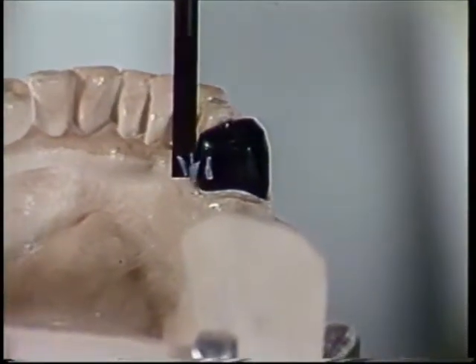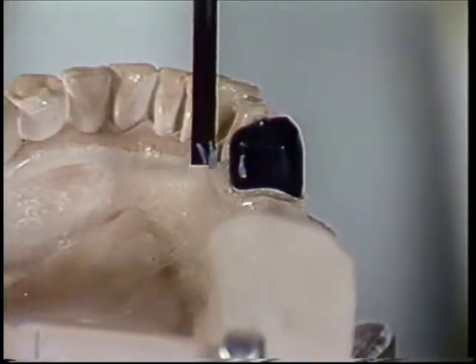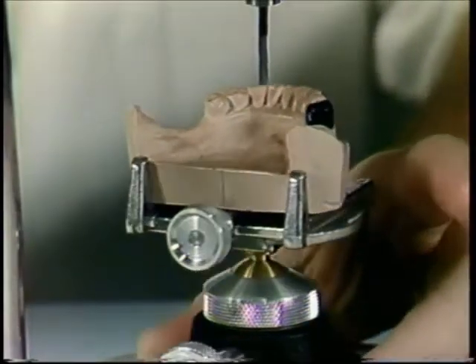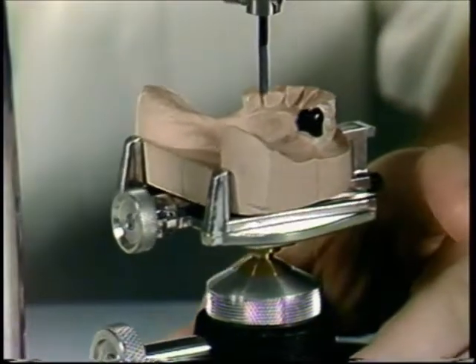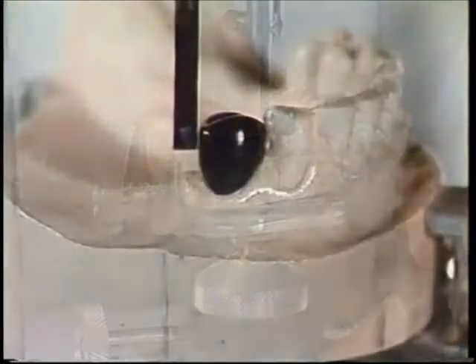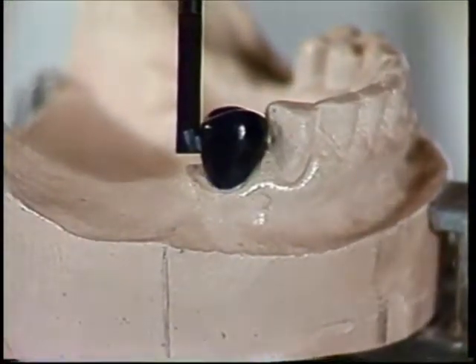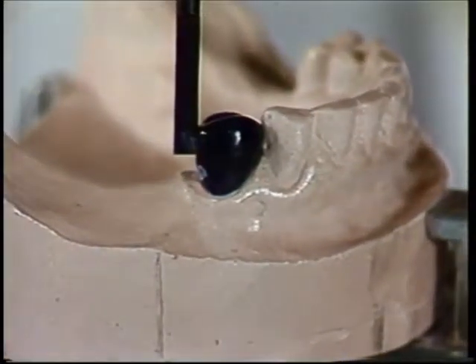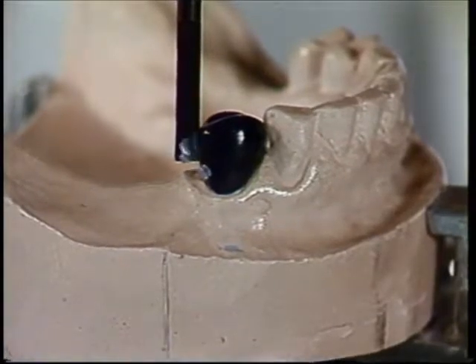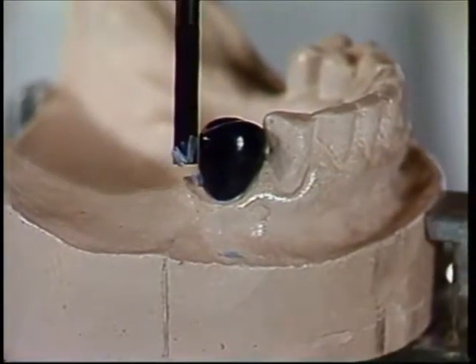Here, the carving tool is being used to contour the wax pattern for a surveyed crown. The carving tool may be used to place guiding planes as well as lingual contouring. Other simulations may be performed on the stone cast. If it can be done on the cast, then it can be done in the mouth.